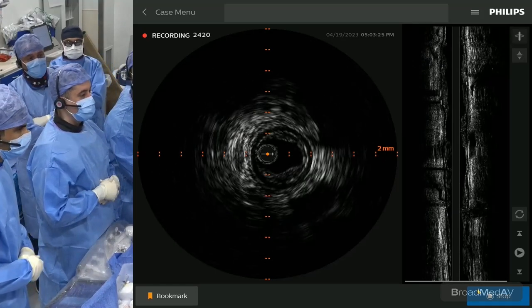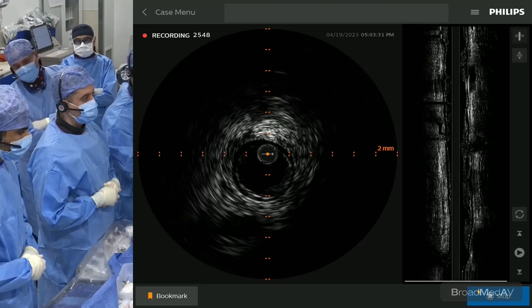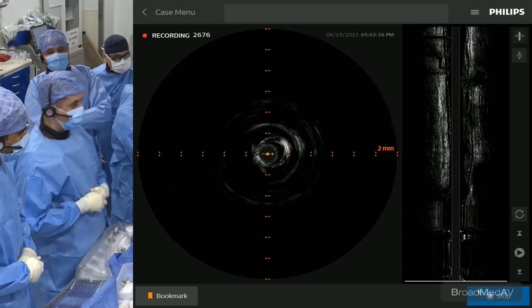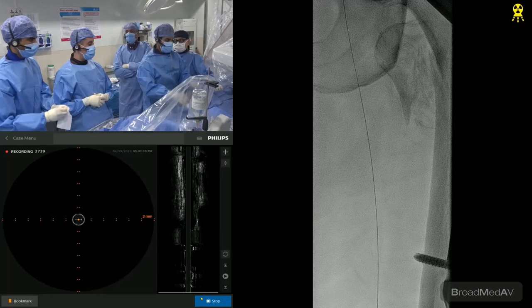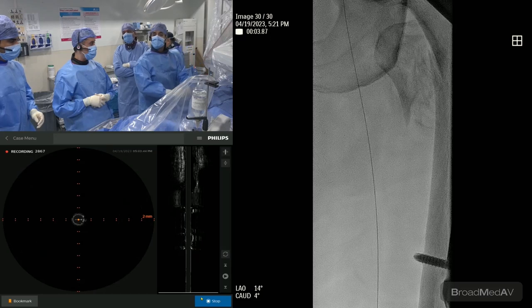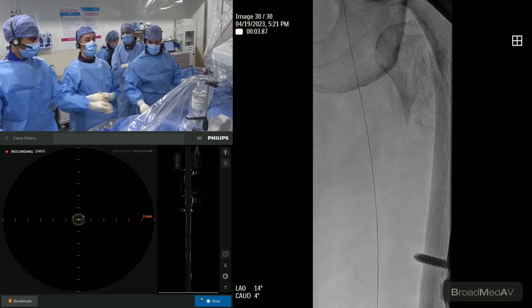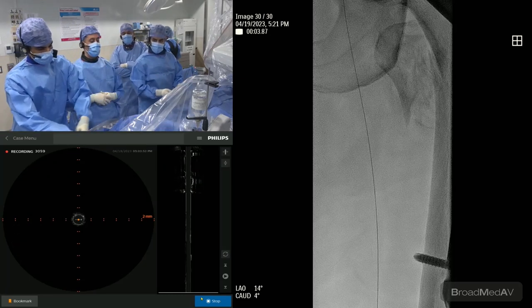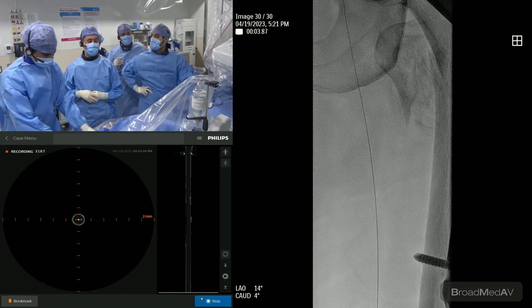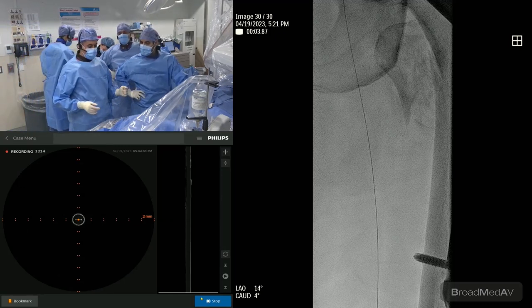Now that Raman has done this, and shown you the level of plaque here, I want to go ahead and do a gradient. So do we have a pressure wire, guys? Yeah, give me a pressure wire. What we're going to do is put a pressure wire distal and then balloon angioplasty with the pressure wire in the vessel side by side, because I want to see exactly how we're improving the pressure distal to this vessel. Because the pressure wire is difficult for us to do this, we can actually treat this vessel first, Raman, that particular area, correct, and then do a pressure wire.